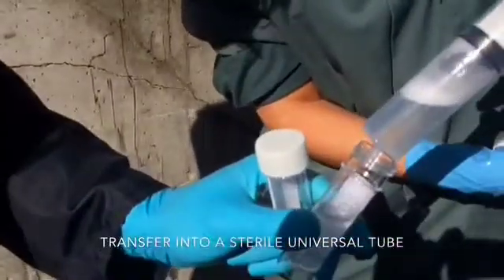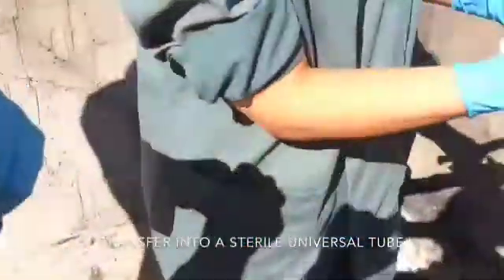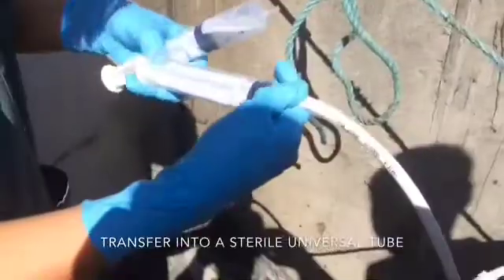Transfer this into a universal tube and send it to the lab for further analysis. Deflate the cuff and remove the tube.